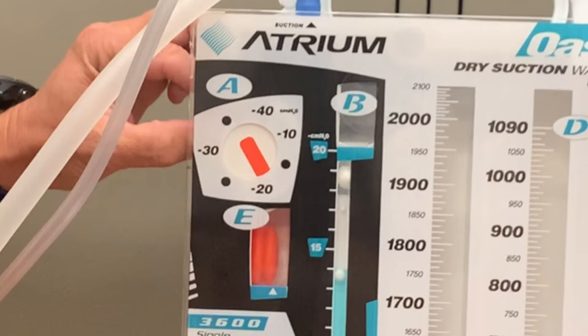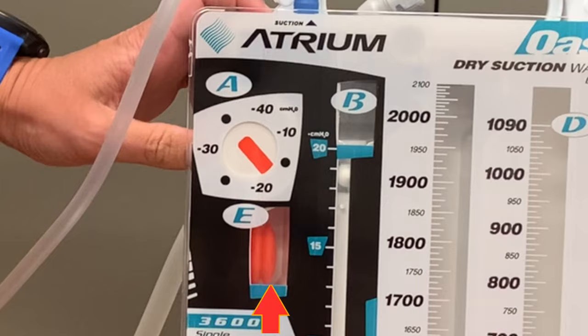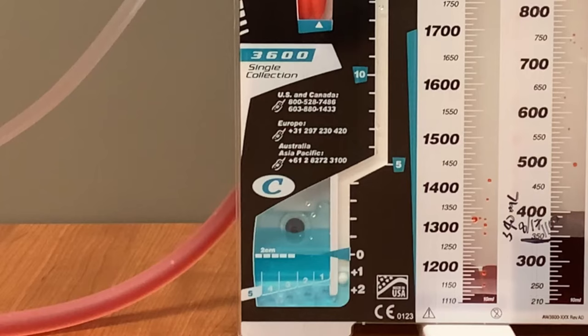As the triangle is the marker to show proper suction when set to negative 20, if the Oasis is set to negative 30 or negative 40, the bellows should expand beyond the triangle. If it is set to negative 10, the bellows should not reach the triangle marking, but should still be visible in the window. The B chamber represents thoracic pressure. There is a small white ball that will float on the fluid as it fills this chamber. The fluid, and ultimately the ball, will likely fluctuate in this chamber with patient breathing and movement. From a bedside nurse perspective, there isn't much to be concerned with for this chamber.